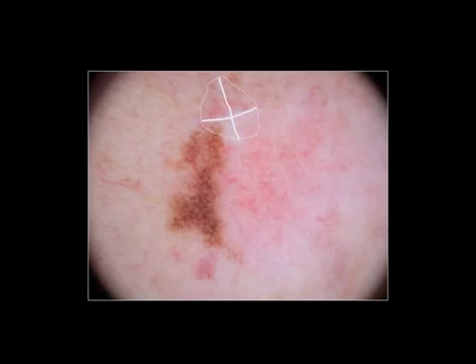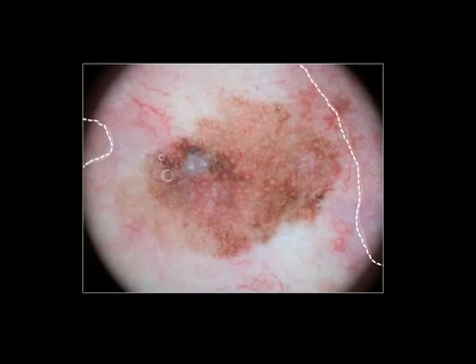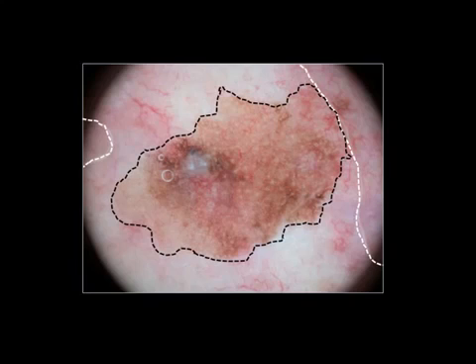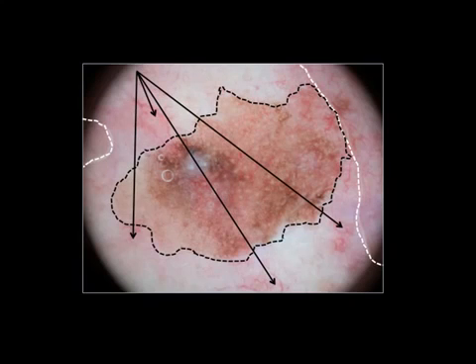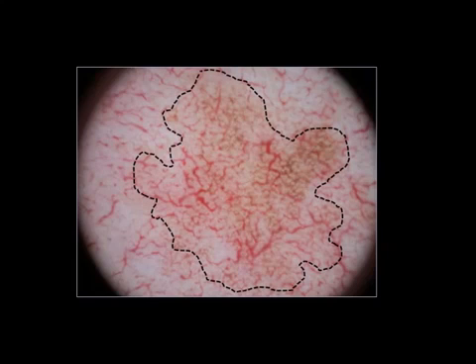Again in this lesion, which was very regressive on histopathology, we can see at the borders that the vessels are very different — much denser inside than outside. Again in this case the vessels are different: outside arborizing and not in focus, and densified in a different shape inside. However, this does not apply to every case — in some cases the vessels are exactly the same outside and inside the lesion.